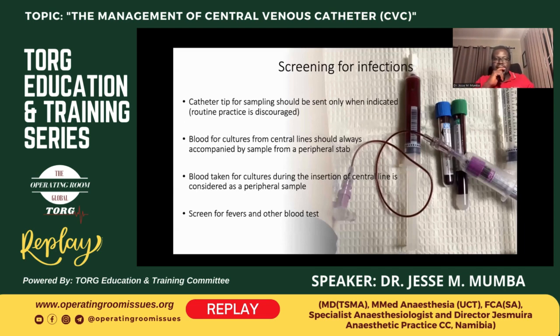Continuing on the bundles. Now, if you ever suspect that there is probably an infection, the patient starts to spike temperatures, or there's a change in the blood workup in terms of infective markers, how do you go about doing your tests?